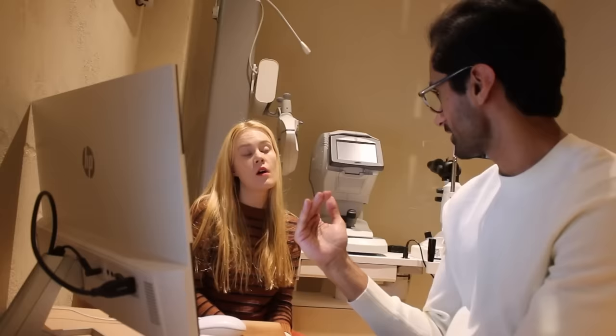You could wear the glasses for television, if you're going to gigs, theatre, that kind of stuff. If you were to drive, legally you'd probably need them to meet the requirements. Fair enough. But it's kind of down to you how much you want to wear them. It's not at that level where I'd advise full-time wear or anything like that. Just up to you. Or contact lenses, I guess, are an option as well.